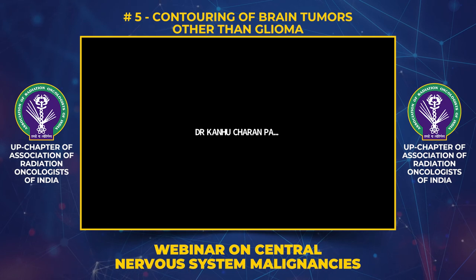Usually we take a planning CT and a planning MR. We have a protocol, as I showed in one slide, of 12 things we ask for in the planning MRI. We have a printed paper with these 12 lines that we give to the patient, and we inform the radiologist beforehand. We don't find any problem regularly with fusion issues.